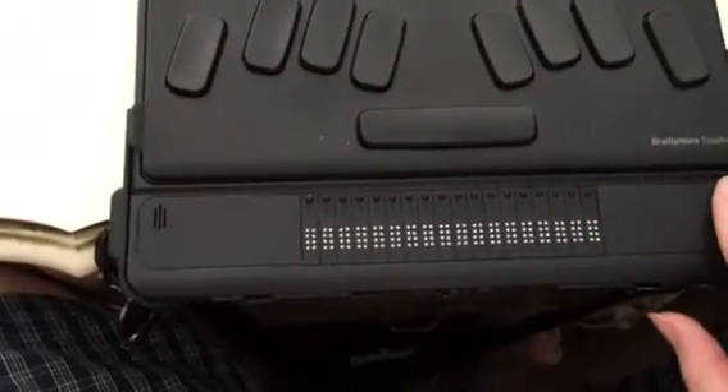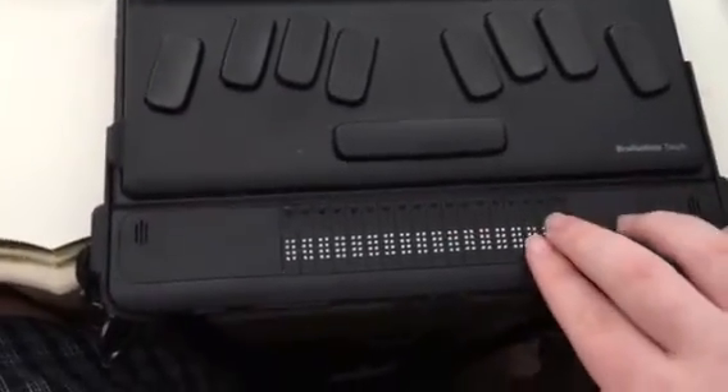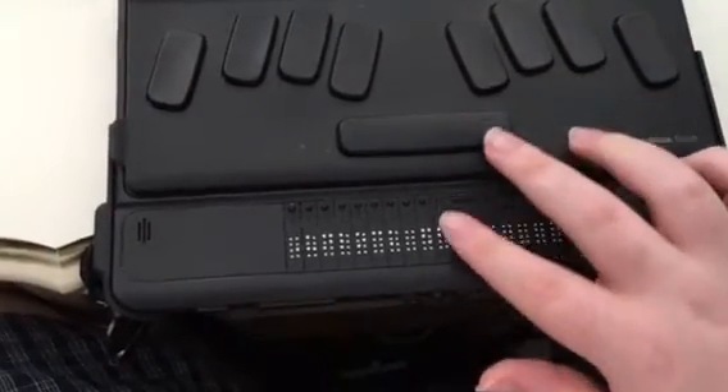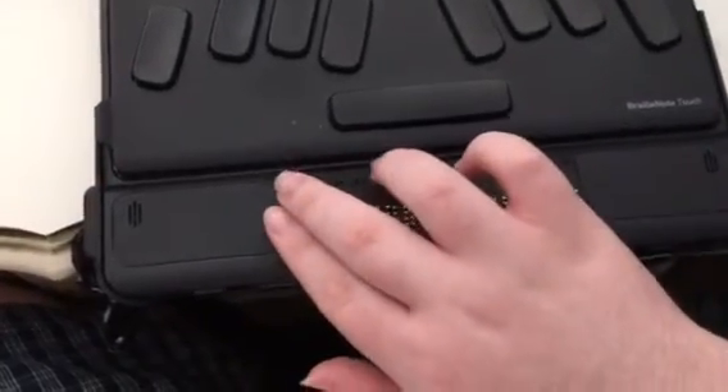Now the other method — you can access the unlock button in a couple of other ways. If you press space with dot 4, you come to the unlock button. Then you can either press enter or you can press any cursor routing key.